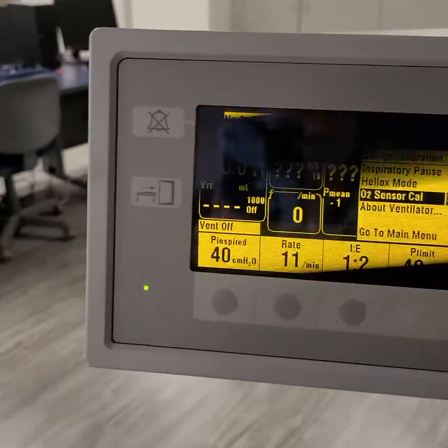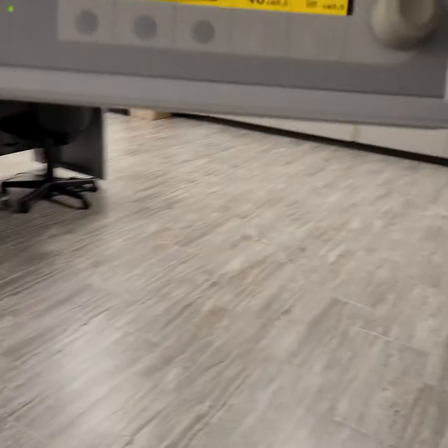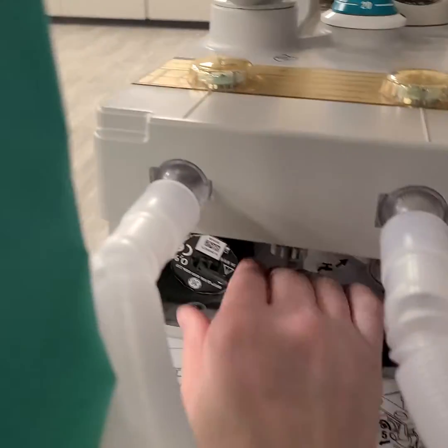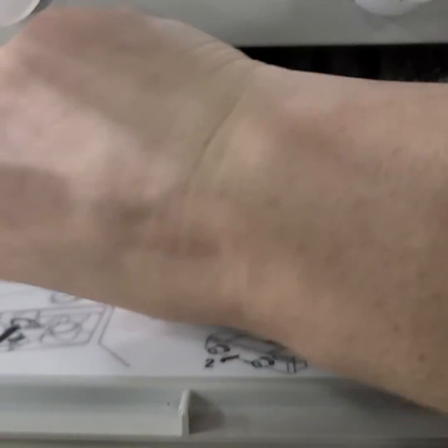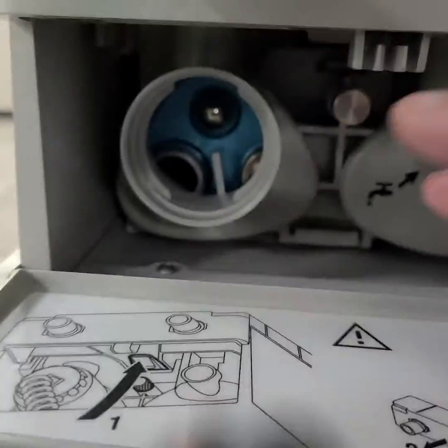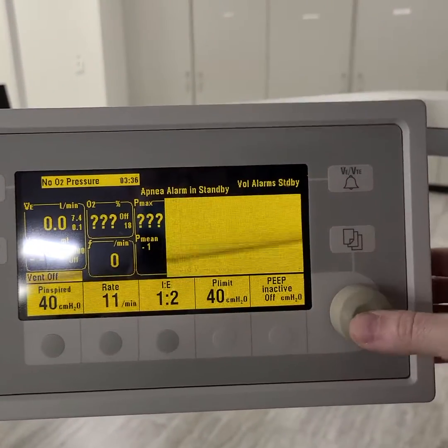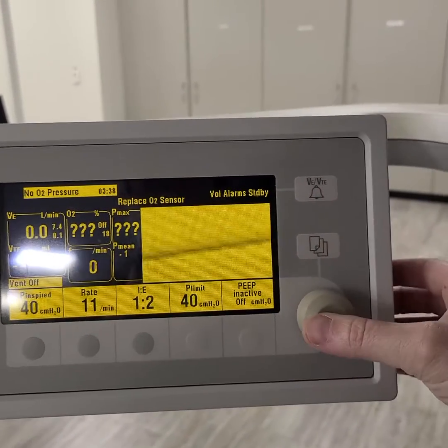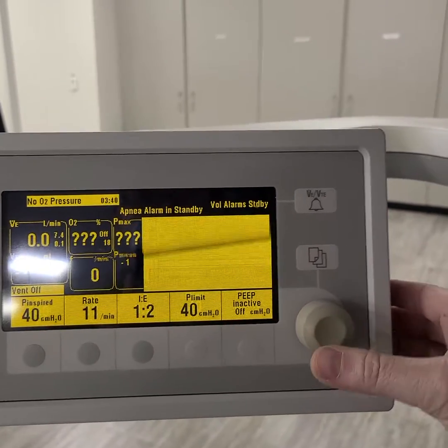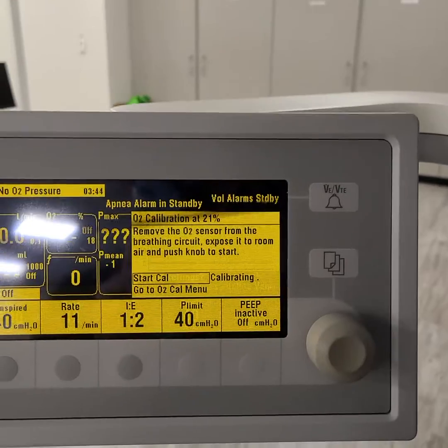Making sure of what this is — 21% is what we will choose. Start calibration. It's calibrating.